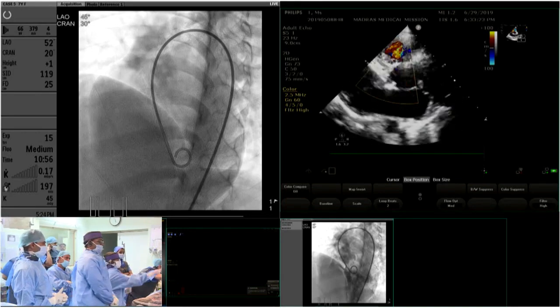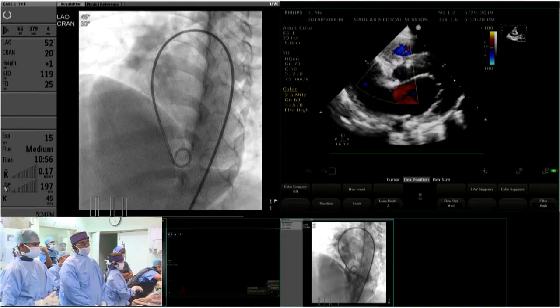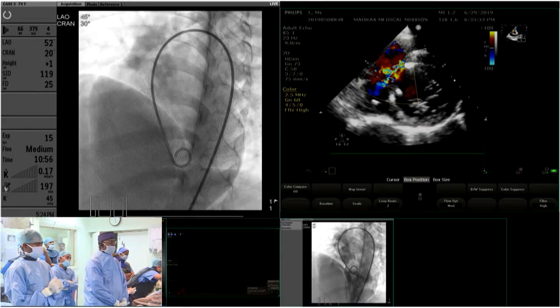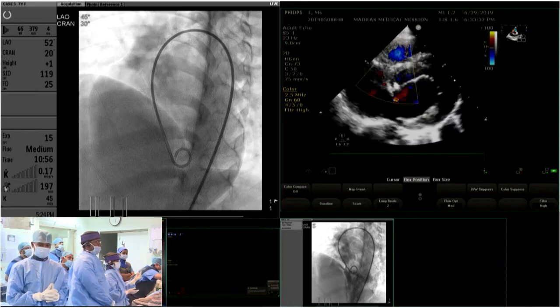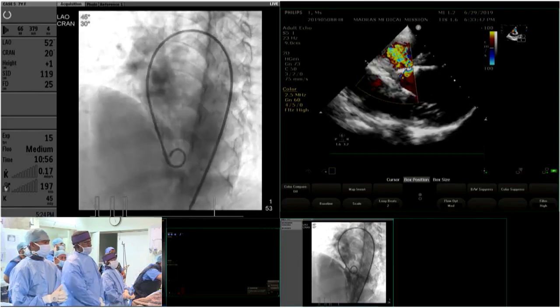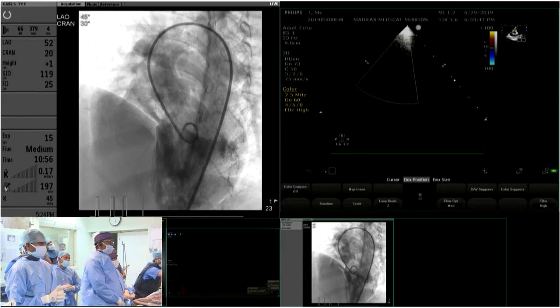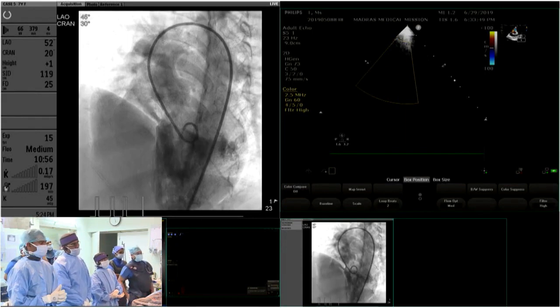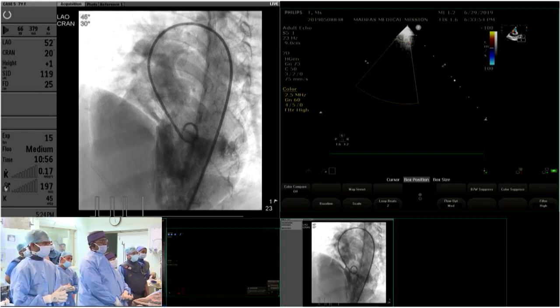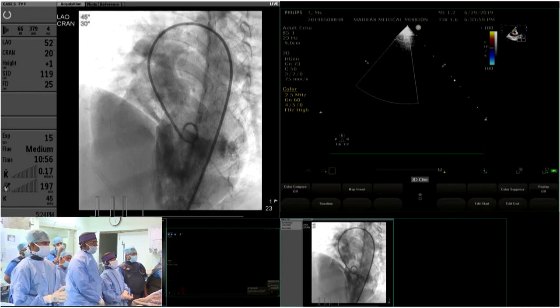Show the perimembranous VSD. Sweep down. Jesse, what else do we need from information? You're going to show us a left ventriculogram, I assume. Yeah, so left ventriculogram we are going to show now. Show the angiogram. So this is the left ventriculogram. Freeze the frame. So you can appreciate a small separation from the aortic valve. So the aortic valve is reasonably safe. But I can tell that in the short axis view, it was a little bit closer towards the tricuspid valve.